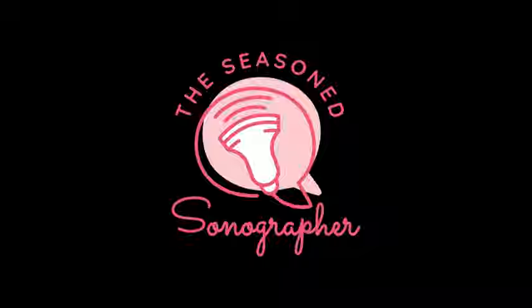When you image the fetal cerebellum, you'll be transverse in the head. The cerebellum sits posterior in the fetal brain, and you'll want to look at it for shape, and you'll want to measure it. Transverse, it always should correspond to gestational age. The cisterna magna should be measured.